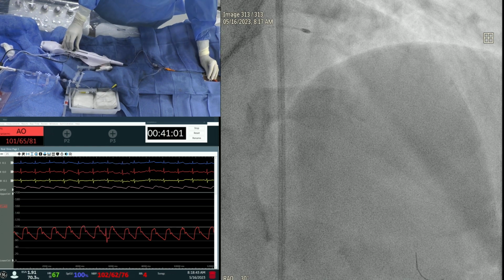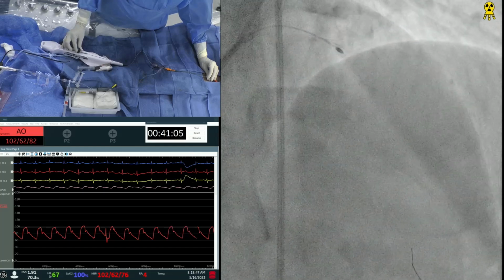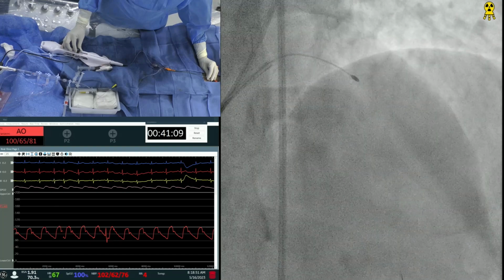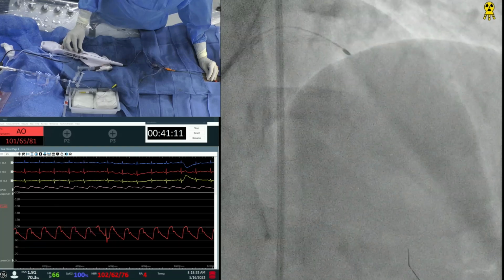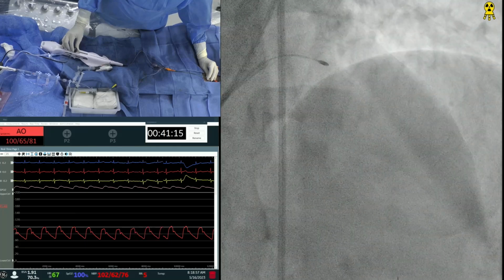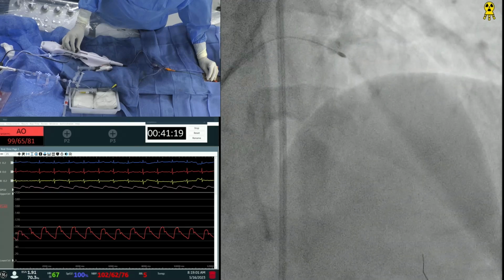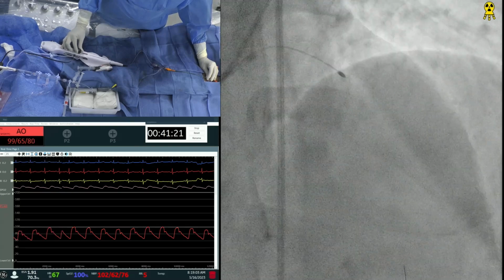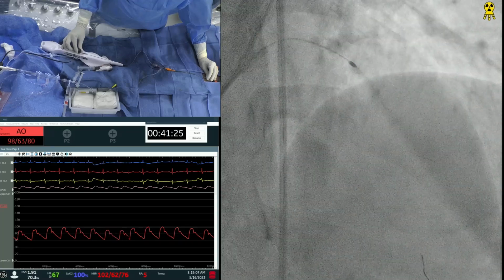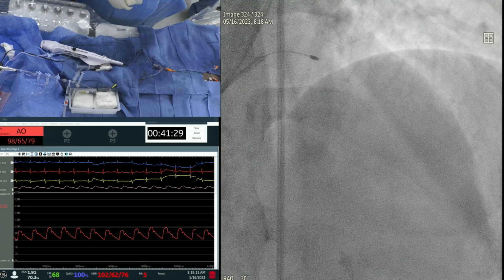So what is the purpose of the IVL? To have a good lumen expansion. So you do a balloon. If you can open it, then fine. Otherwise, you would just add IVL. Or you can use a cutting balloon. We have done the Rota-Cut trial. We are waiting for the data of 60 patients, whether adding a cutting balloon gives you a better lumen. We're still waiting for it. But otherwise, you use IVL if the lesion did not open. If the lesion opened, then no. Are you a little surprised about the challenge the rotational ablation is having here?